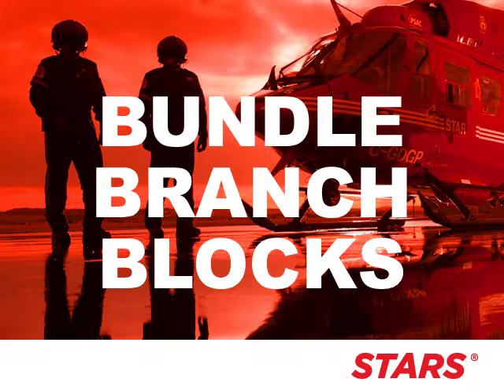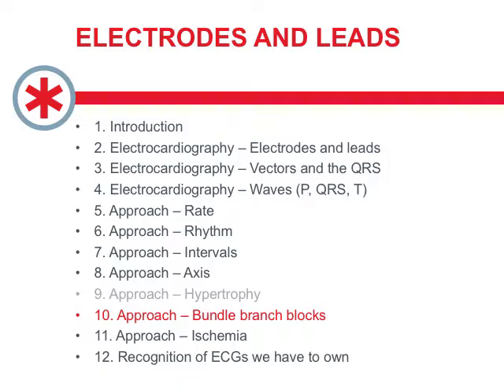So welcome everyone to the bundle branch blocks lecture and lesson. And as you can see, we are rapidly approaching the end of our approach to the ECG, perhaps thankfully.